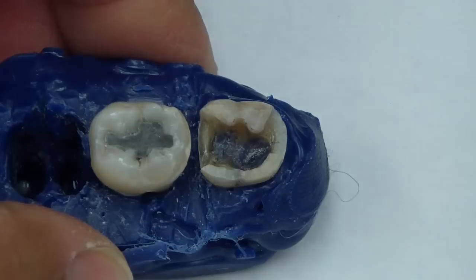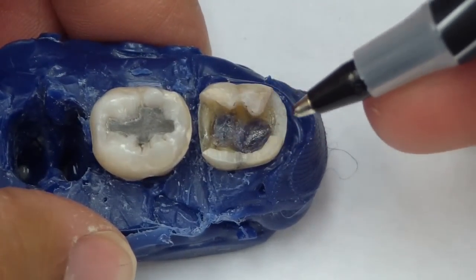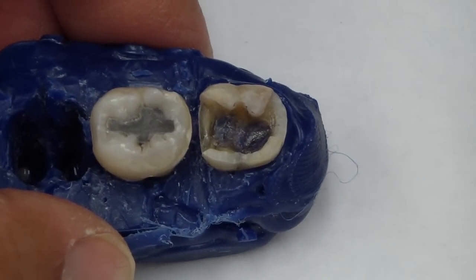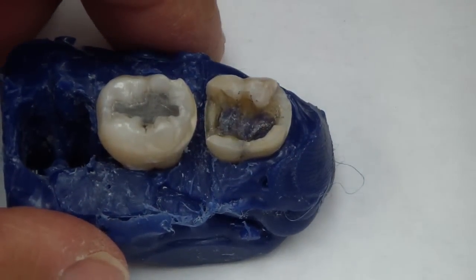You've seen this tooth a few times. There's a large amalgam restoration and I removed most of the amalgam restoration, just about in preparation for restoring. Now one of the things I was talking about — I've gone around the building and asked opinions about how you restore, and the endodontist came up with a really interesting thing about translumination.